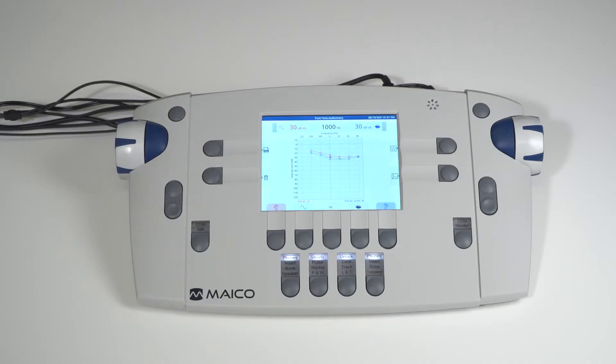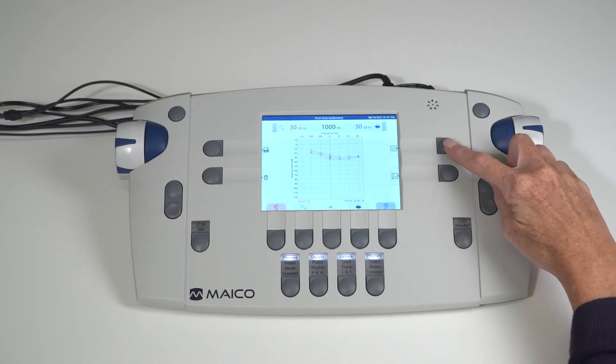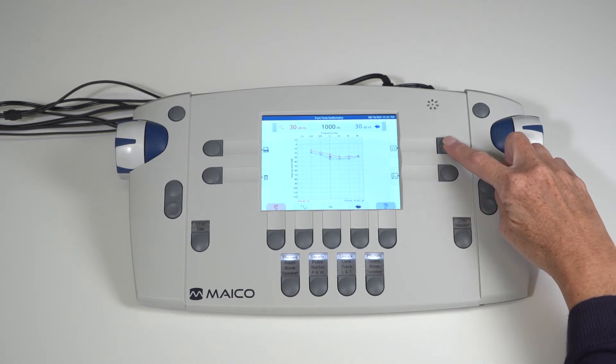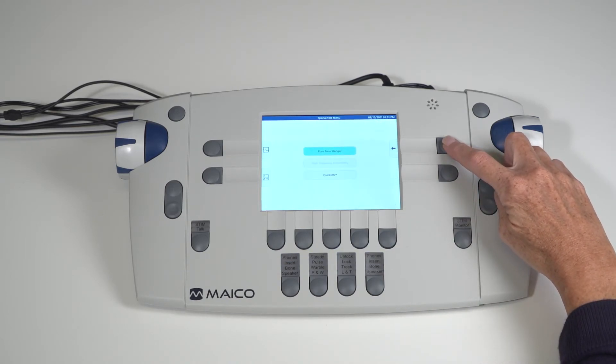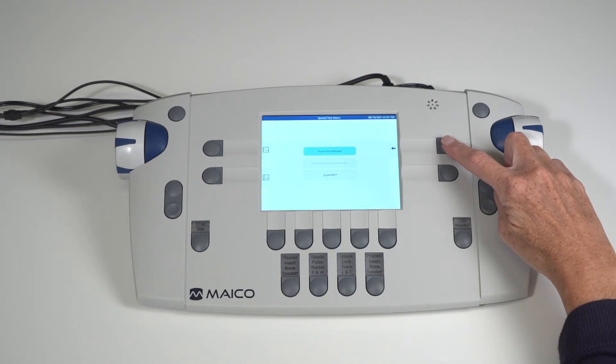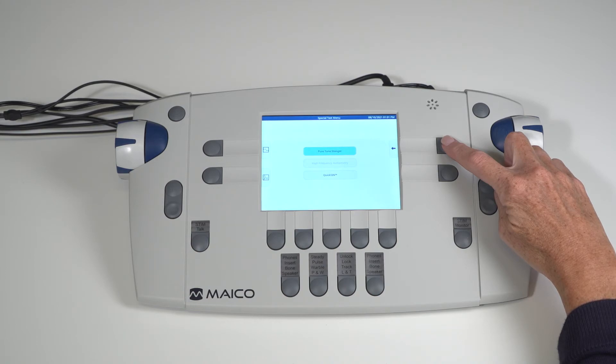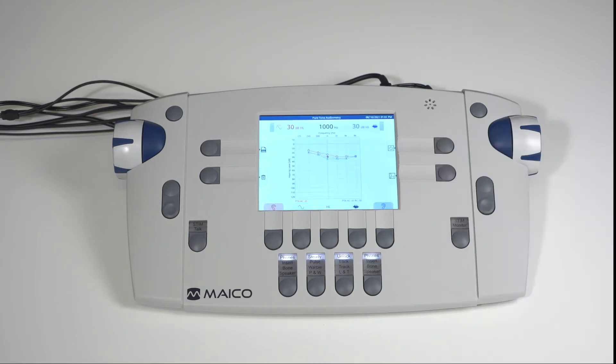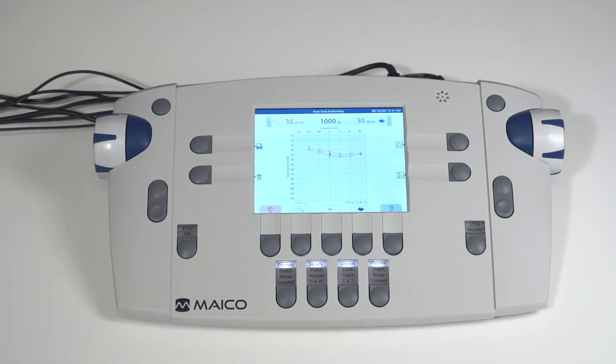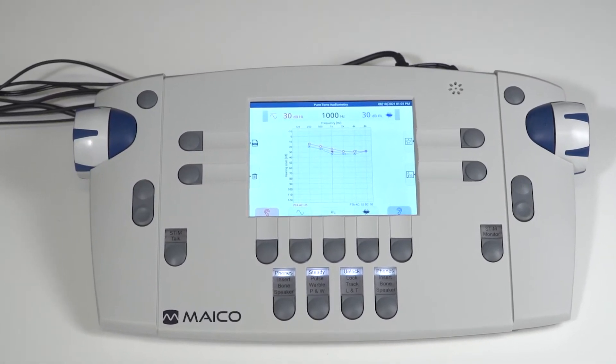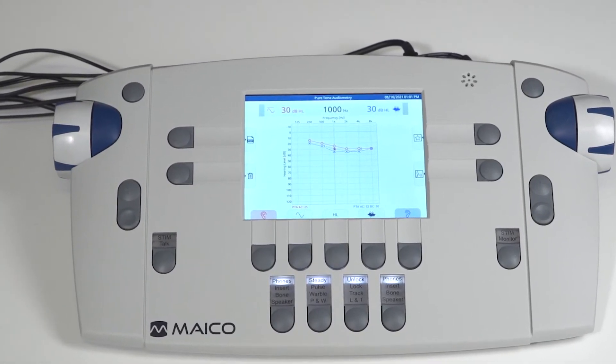Special tests are testing options with unique test screens or default device setup for quick and easy operation. Select the special test key to access the available tests. This list will vary based on the included special test and those license options purchased separately. Selection is different based on device setup or test screen.